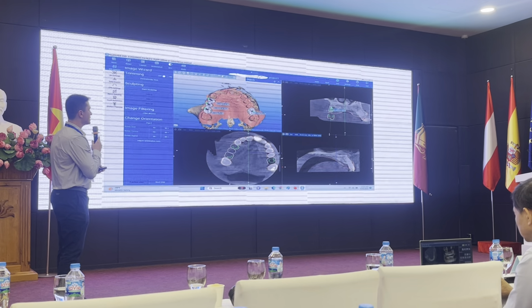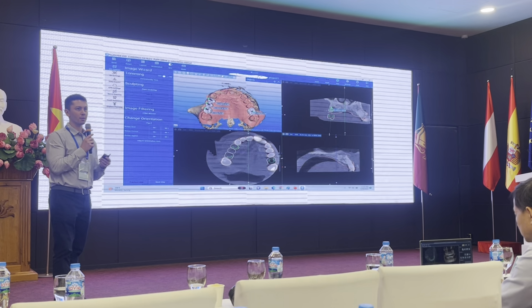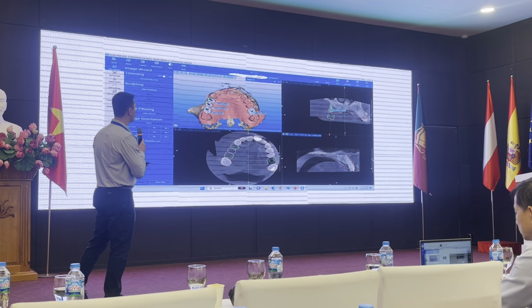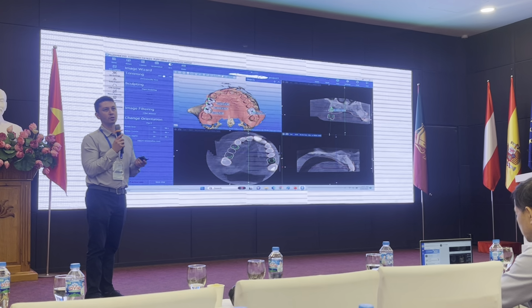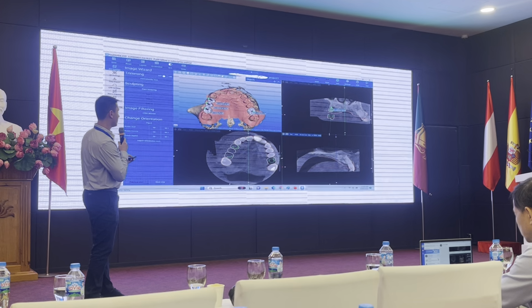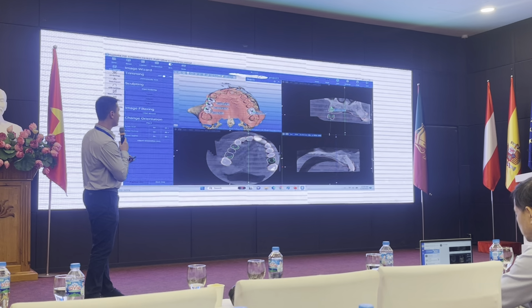Sometimes with these empty spaces, there's less space than what we really need to put the proper shape of the tooth there, and so sometimes we have to look at changing the shape of a tooth that we would like to place. Sometimes we don't have room to put a molar right there. We might only have room to put 1, 2, 3 premolars.